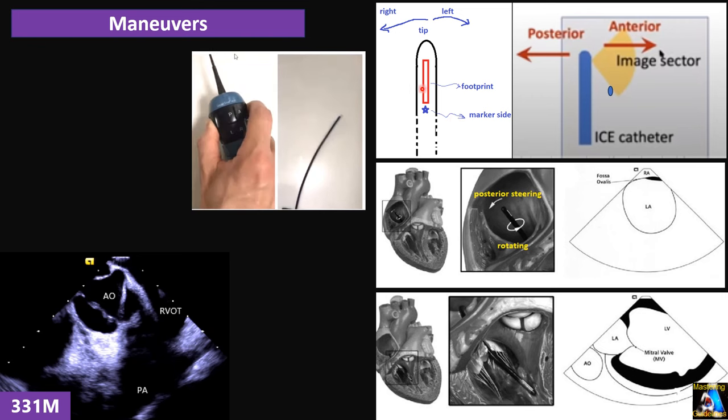However, in image D, once we're close to the Eustachian ridge, we can demonstrate the difficulty in achieving adequate catheter contact at the subeustachian portion of the isthmus, limiting RF delivery. Image E shows a more lateral approach, which also is limited by the Eustachian ridge movement and its prominence.